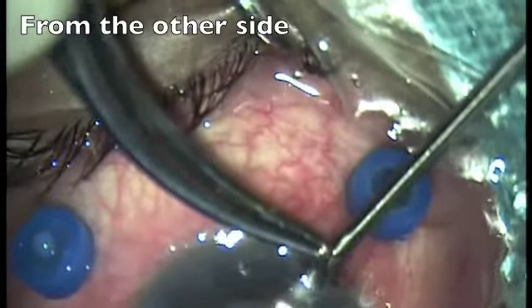This is the entry from the other side to treat the rest of the ciliary processes.